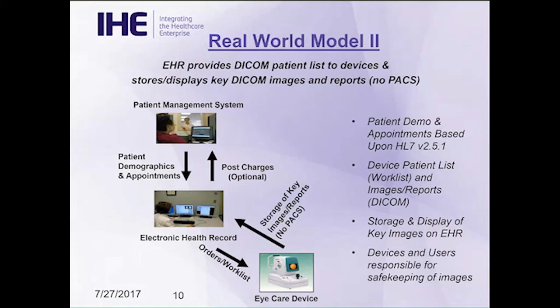So what happens now is the EHR does the DICOM work list, the patient list, and it automatically feeds that data to the devices. And again, each device then has to select that patient and do its output. But this is where things differ. At this point, there is no PACS in the system.